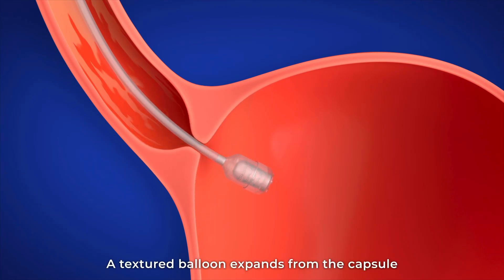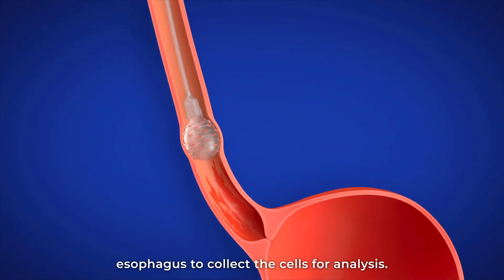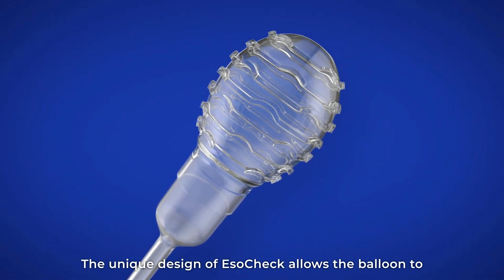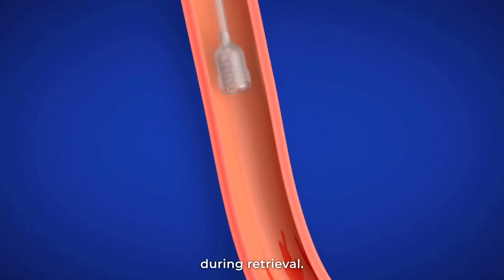A textured balloon expands from the capsule to swab the surface of the lower esophagus to collect the cells for analysis. The unique design of ESOCHEC allows the balloon to invert back into the capsule, protecting the cell sample during retrieval.